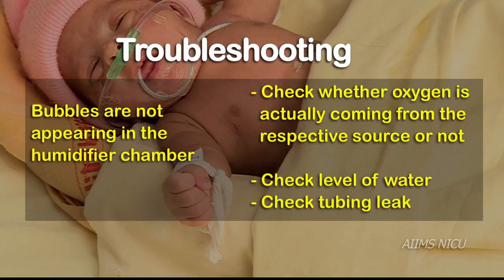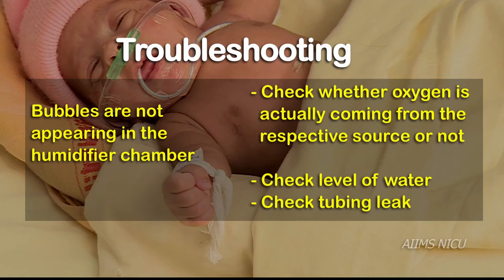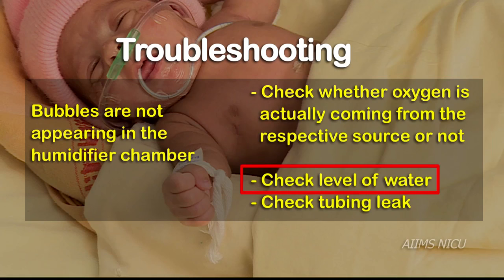If bubbles are not appearing in the humidifier chamber, check whether oxygen is actually coming from the respective source. In addition, the level of water in the humidifier chamber should be at the correct mark, and the tubing should be checked for a possible leak.